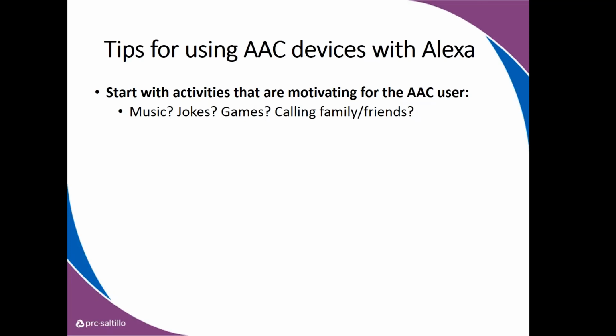So you can call from your Alexa device using your own voice, your AAC voice, when all voices are equal. It will call that contact from your list on that same smartphone, so you can actually practice calling family and friends and having conversations with others through your Alexa app.